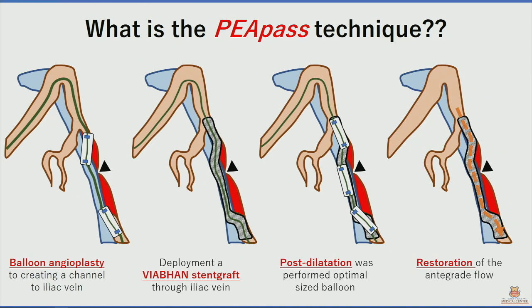It's almost the same procedure as a PQ bypass for femoropopliteal occlusions. But of course, it's a little bit dangerous compared to the femoropopliteal.